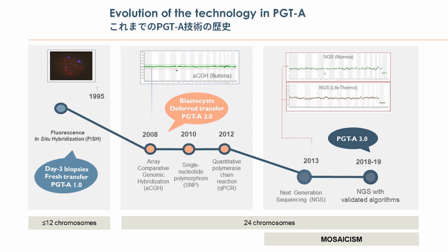So this technology was working more or less up to 2010, and around 2010, the molecular technologies that were applied to blood or to other kinds of tissues were improved, and we were able to apply molecular technologies to the small amount of DNA that we have in a single cell or in a few cells from the trophectoderm biopsies. And this was a big change, because we were able to analyze not only one cell, we were able to analyze 4, 6, 7 cells from trophectoderm biopsies.